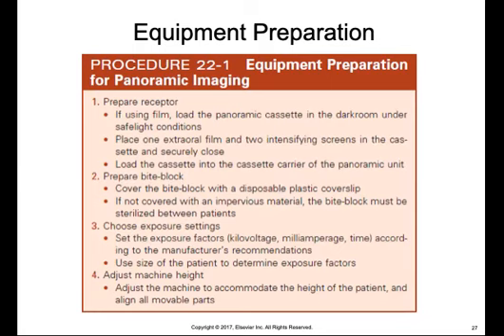Okay, you never want to ask your patient to bite on something that is unprepared or to adjust the height of the machine while your patient is biting down on the bite block. This can cause injury or discomfort to your patient.